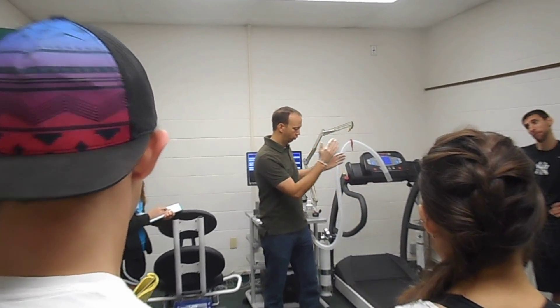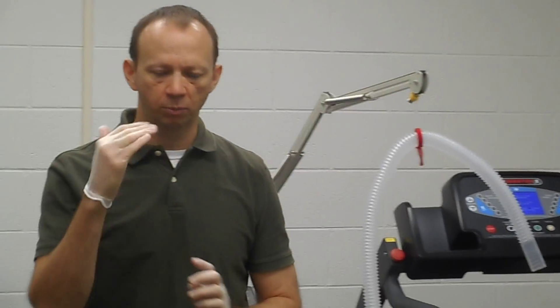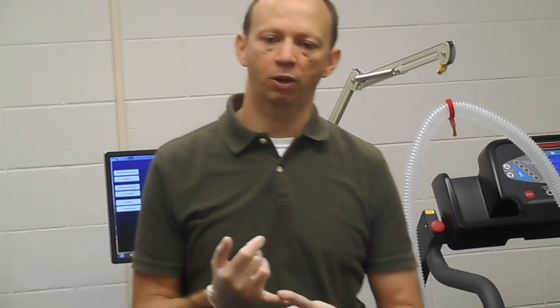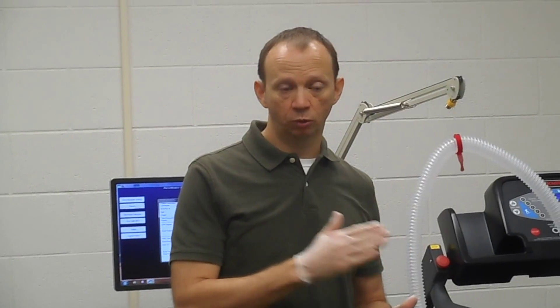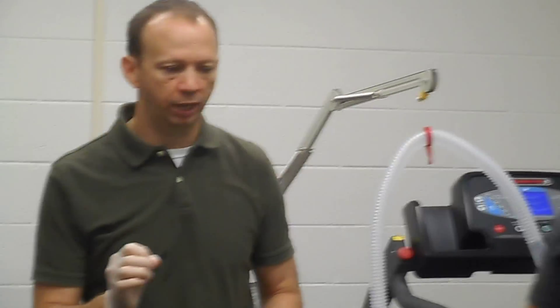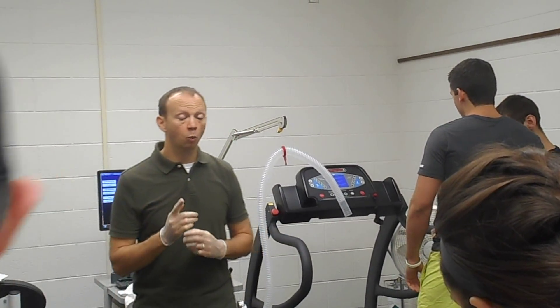Zach is going to do a VO2 max test on the treadmill. This is the procedure we'll utilize: it's going to start out walking and then every minute it's going to get harder until he's running. For the first minute, three miles per hour, then four, five, six, seven, then eight. After we get to eight miles per hour — at zero grade the whole way through — the next minute we'll go up on grade by four percent grade until he reaches exhaustion.